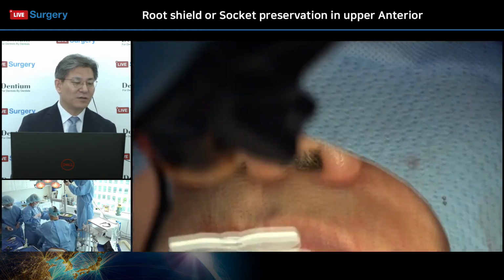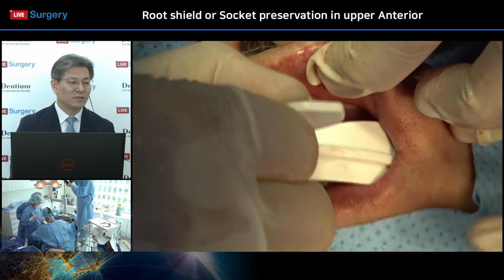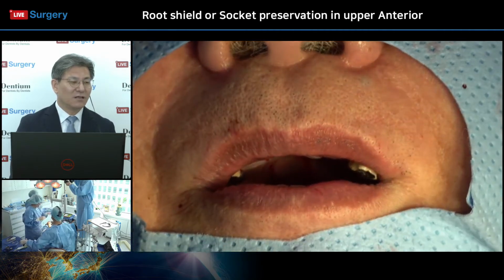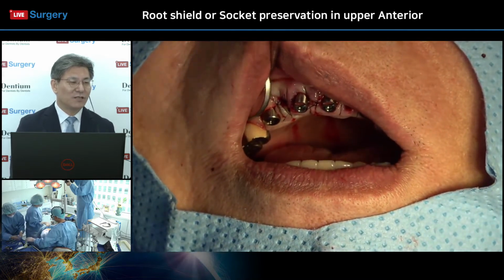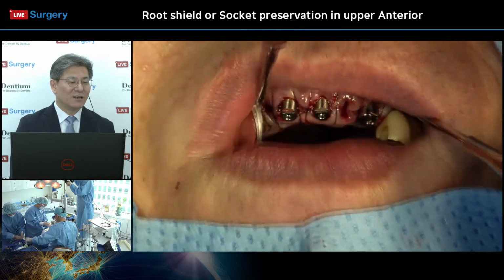This bite tray technique is very useful. The bite tray, very useful. Actually, one shot, 3 kills. Actually, we can get it.